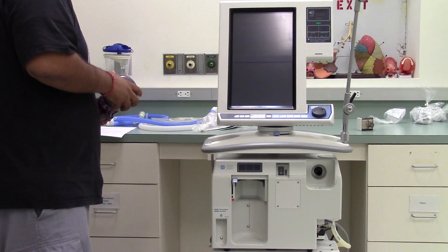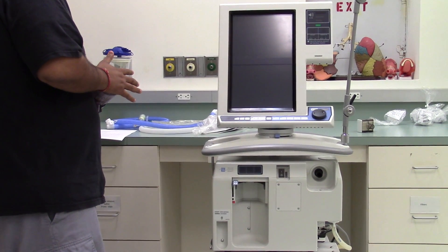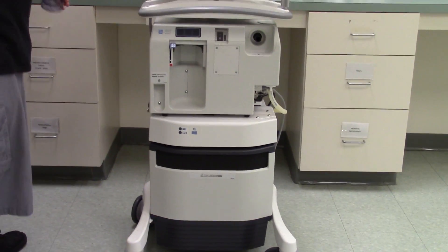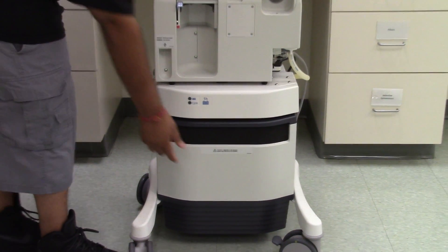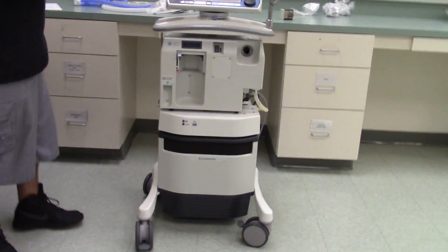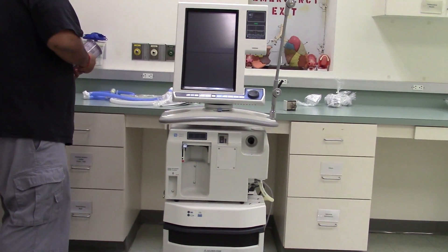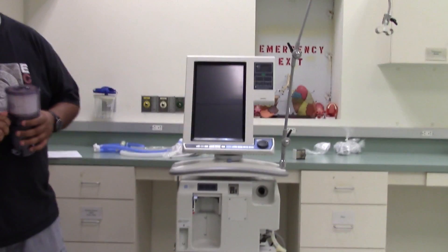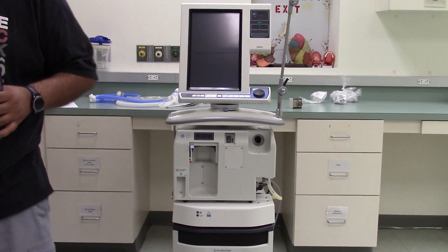However, this ventilator has an air compressor that will generate 50 psi air. It is the big box that occupies the lower part of the ventilator — you can see it at the bottom. So if you do not have an air outlet, this ventilator will work without that.